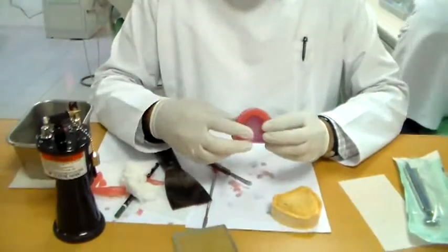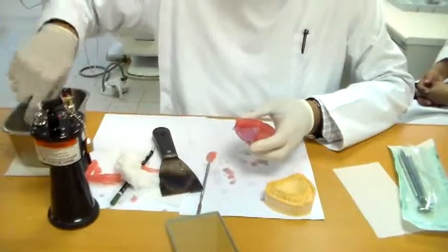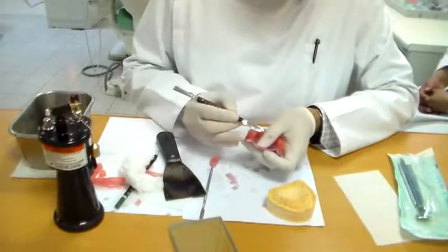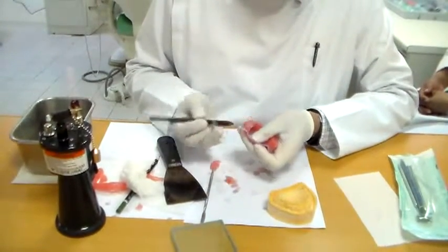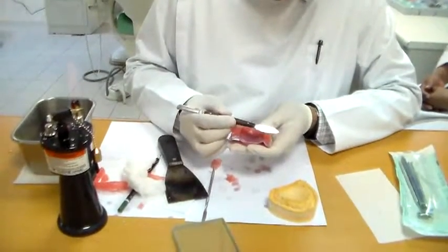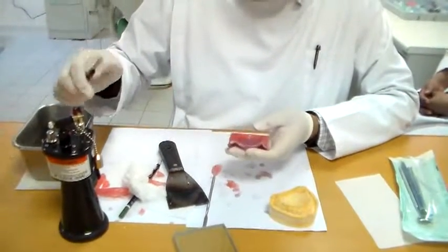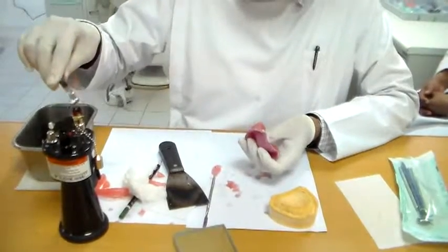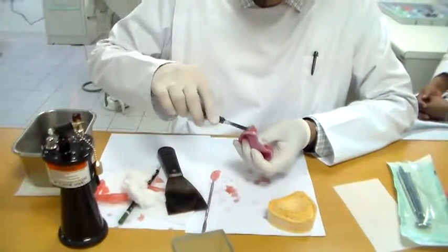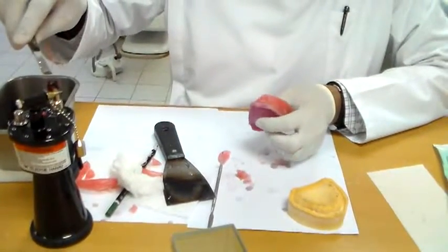Now at this point you want to focus on getting your canine eminence as well as the posterior part correct. I would remove a little bit of this wax here. Angle it a little bit after the molar region. Here also. Come around the sides. Around the side. Seal it. Okay.